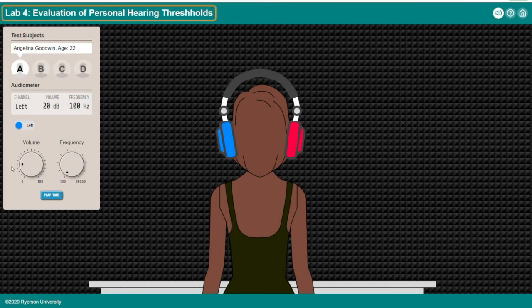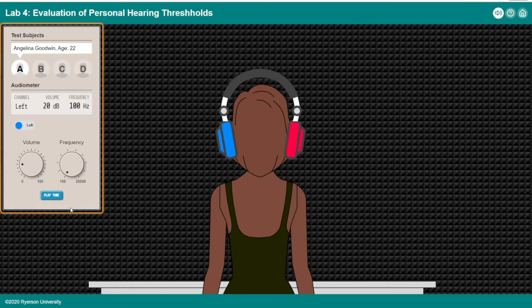Control panel for a simulation of an audio meter. Choose between different test subjects with different hearing thresholds. Use the arrow keys to enter values for volume and frequency, and use the space or enter key to interact with other controls.